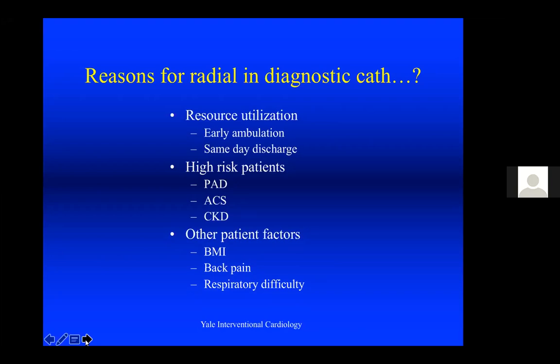And those are not life and death things, but they are very important to patient safety and comfort. And patient acceptance, I think most patients who have had the procedure done through radial access really prefer that over femoral access for a variety of reasons.